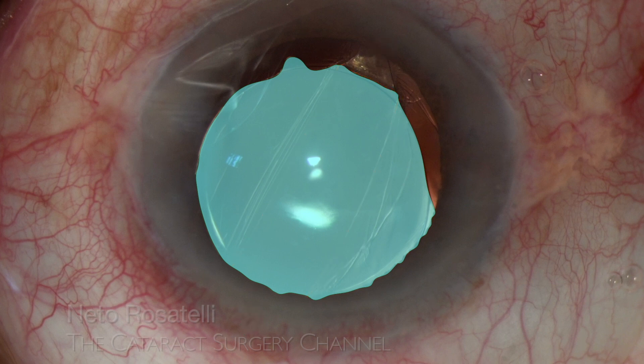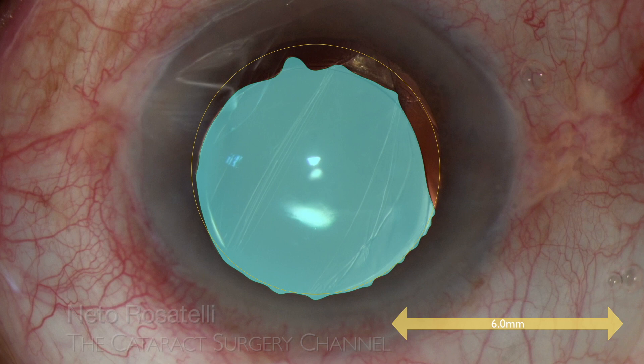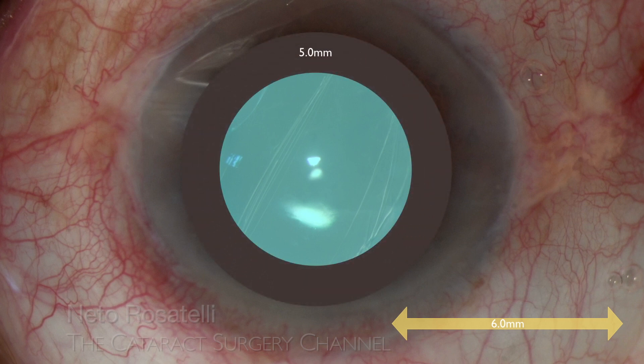Now let's see about IOL centration. By using the 6mm IOL optic as a gauge, we can measure things. Pupil contour is highlighted also. By simulating a 5mm pupil, we can see that the optic is fully covered. That's probably the maximum pupil size this elderly patient will have in scotopic conditions.